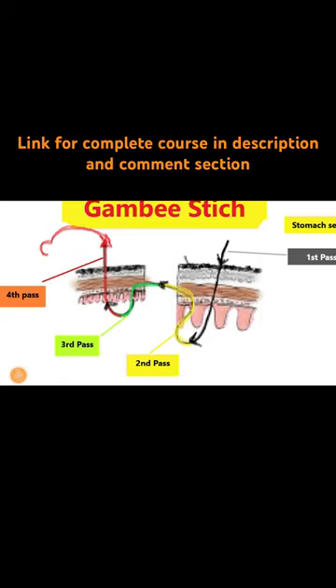Followed by red. The first stitch, as I said, is through and through from serosa to mucosa. We have demonstrated this in the pyloroplasty — just imagine the stomach serosa is towards your right side and towards the upper part of the screen.